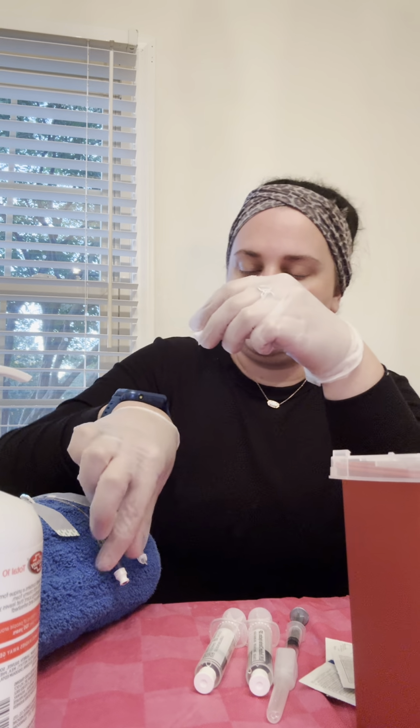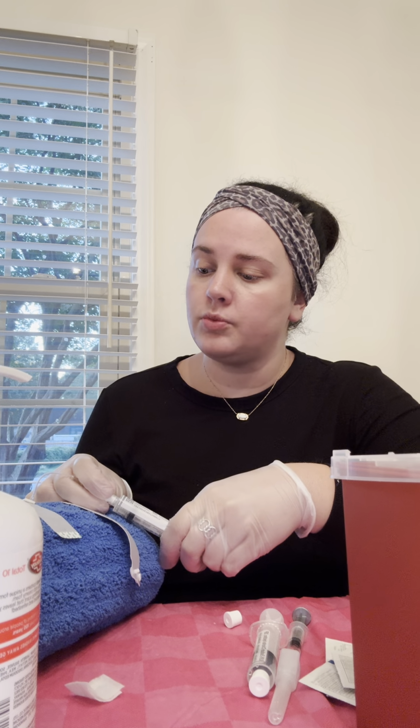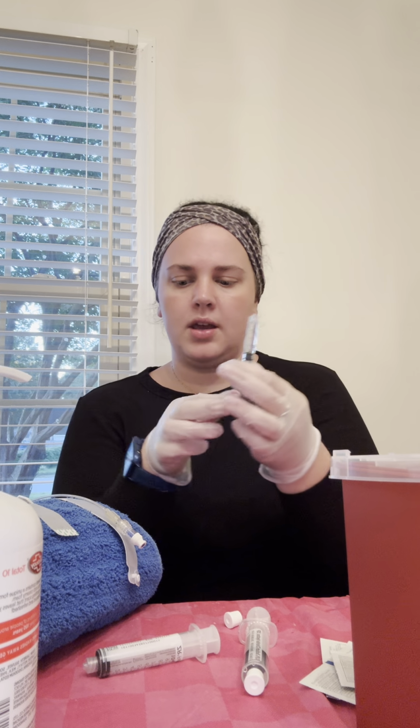Okay, and we'll go ahead, clean this port, let it dry, and aspirate on this IV line, pull back for some blood. I am getting it. And then I'll push my first 3 ml of normal saline, in which everything is still flushing smoothly. And I'll clean my port off in between every time we have to push something on there. Here is my med. I'm just going to make sure it's still at the 2 mLs.